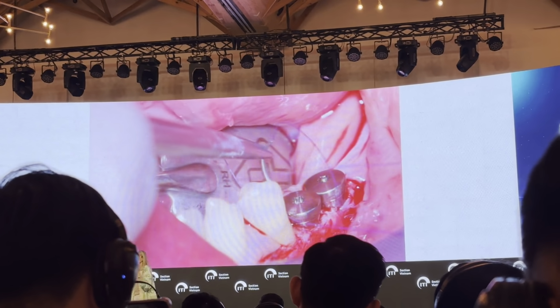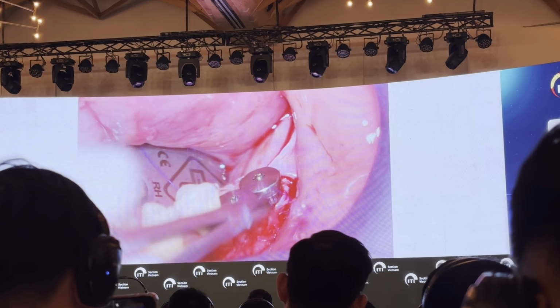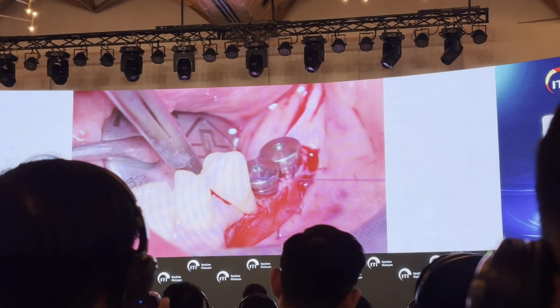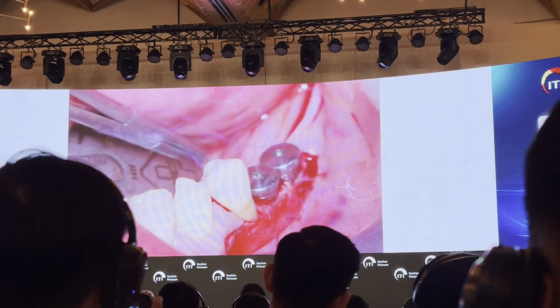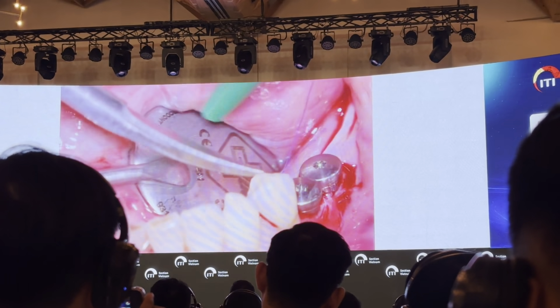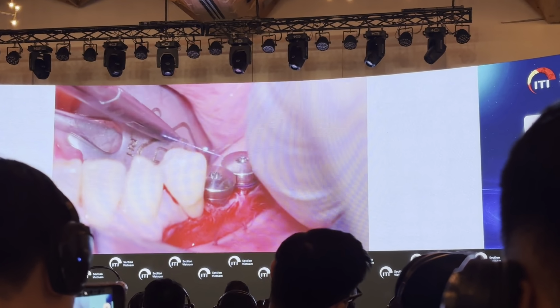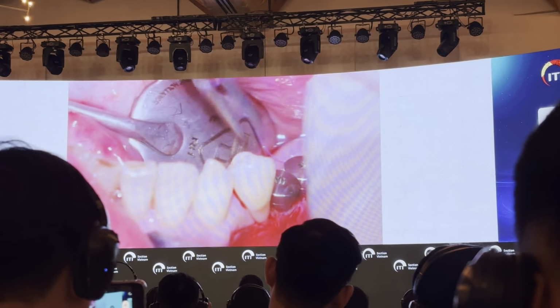So now we stabilize the lingual tissue in the vertical position to recreate the keratinized tissue in the lingual aspect. So we suspend the suture around the implant, maintaining the keratinized tissue that was pushed from the occlusal and the buccal aspect toward the lingual side. In order to maintain these tissues as much as possible, taking into account that on the vestibular aspect, we are going to create new keratinized tissue thanks to the free gingival graft.